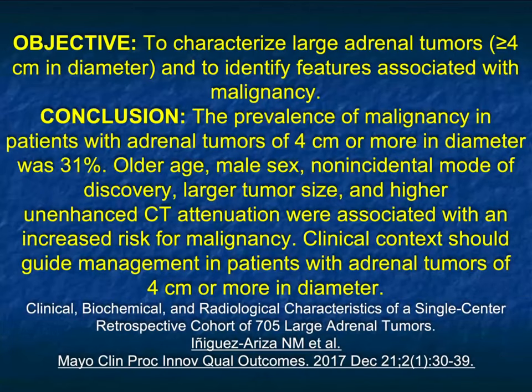So that's my kind of rule breakers to make the point that size alone is not critical, that I think radiologists need to pay more attention to function, and I think we are doing that, particularly in multidisciplinary conference. Now, we always think when something gets large in the adrenal that it's going to be malignant. But this was a very good article looking at a large group of patients.